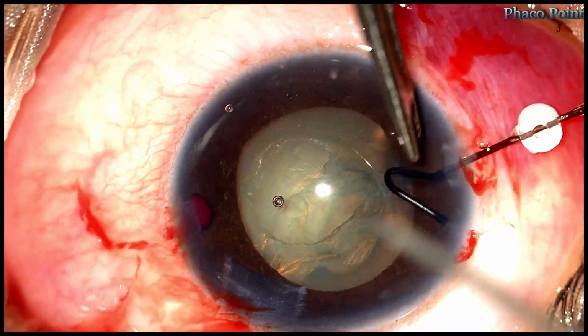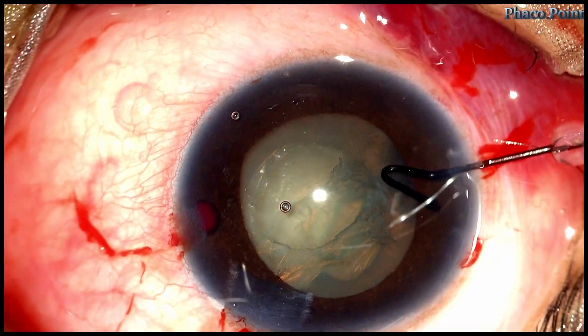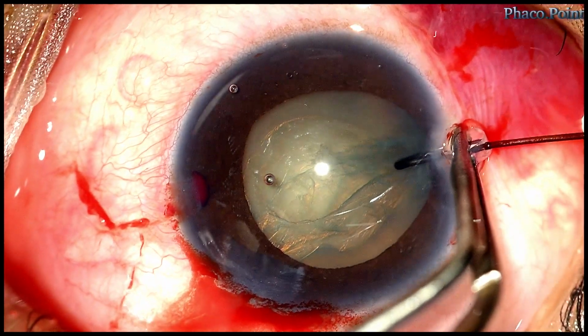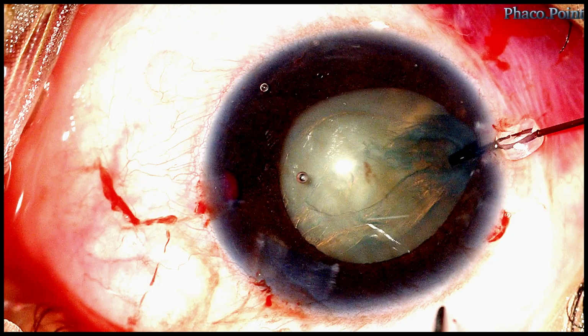The hook is introduced through the normal sized paracentesis incision, the stopper withdrawn, then hooks onto the capsular rhexis edge, after which the entire capsular bag is lifted up and the stopper pushed down towards the limbus, thereby attaining a vertical stability of the capsular bag.